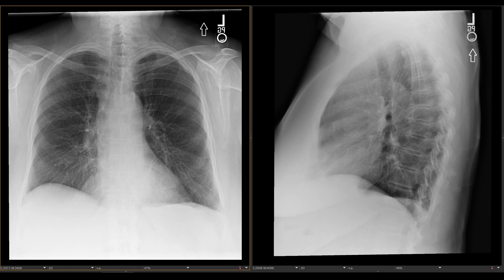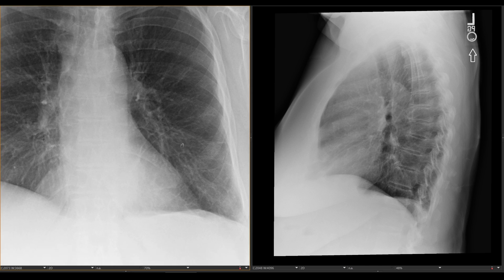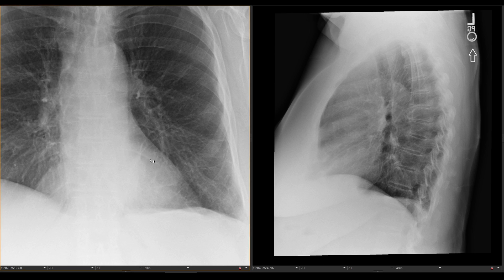Hey everybody, this is Rishi and in this video I'm going to show you another classic case. This case started from this chest x-ray, and if you zoom in on the retrocardiac region, you can see that there's an opacity right here overlying the left heart. Usually when there's something overlying the heart, it's in the left lower lobe. There's very little lung tissue that's anterior to the heart, although there is a little bit.